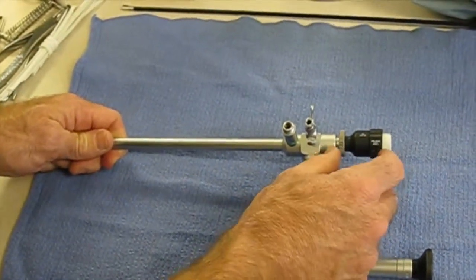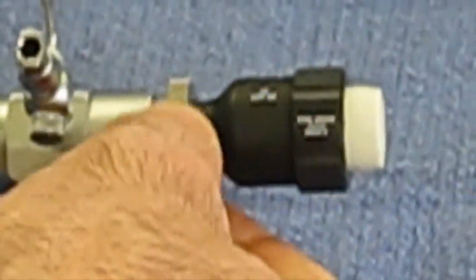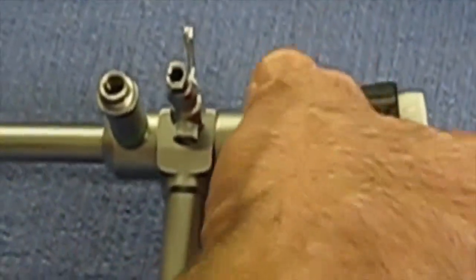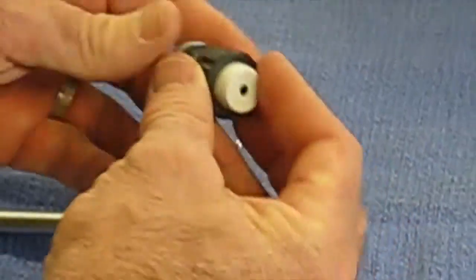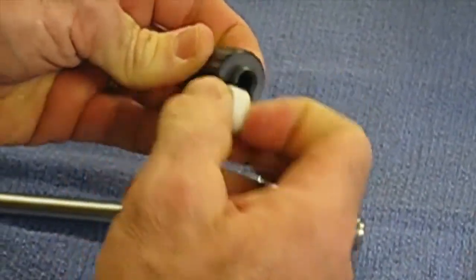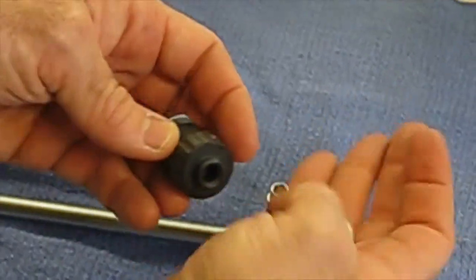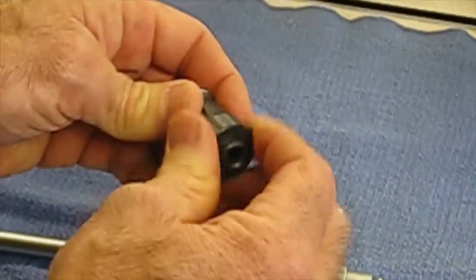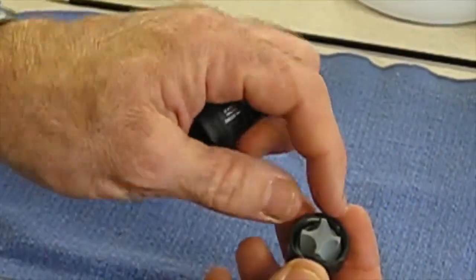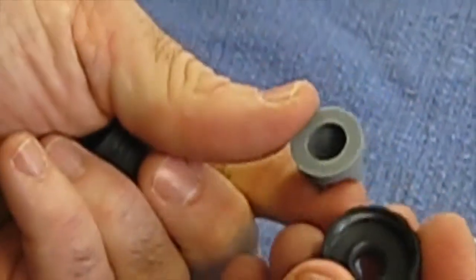But you have this valve here that keeps the gas from coming out of the scope. So you want to unscrew this with the silver ring and take the valve off. Then with this valve, you can take off this white sealing cap. You want to make sure that's nice and clean inside. Then unscrew the black cap to expose the silicone leaflet valve. Take out the silicone leaflet valve, make sure that's clean.